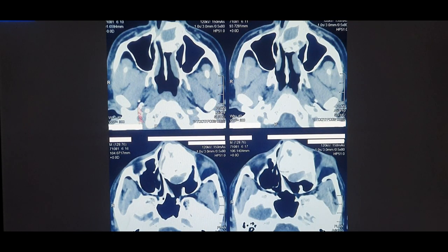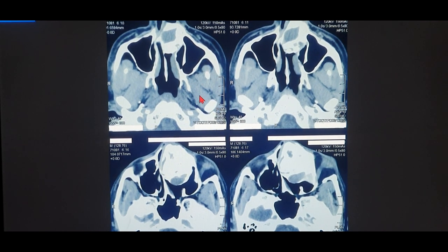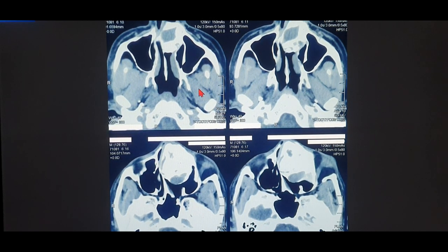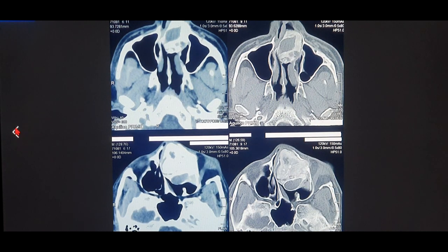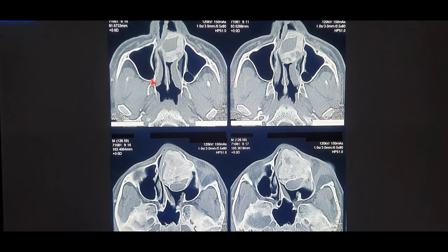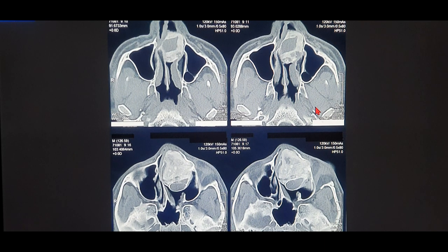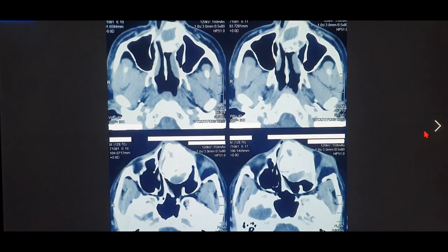On the soft tissue window, the soft tissue appears more intense and brighter - you can actually make out the anatomy of soft tissue differentiation with the bony area. On the bony window, the soft tissue appears darkish gray and the anatomy is a bit more difficult to study compared to the soft tissue window. Structures like the orbit, periorbital tissues, and muscles in the infratemporal fossa are very well visualized on a soft tissue scan compared to the bony window scan.